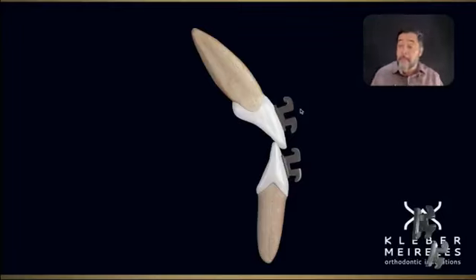And you do that by applying the correct torque so you can have the correct movement, or the least problematic movement in some cases, because we are using this. Sometimes we know that part of the root is going outside of the bone, but if your patient has a good periodontal phenotype, it will keep that position for life, okay? But if you're going extremely out of the bone, it will be a problem at some point.